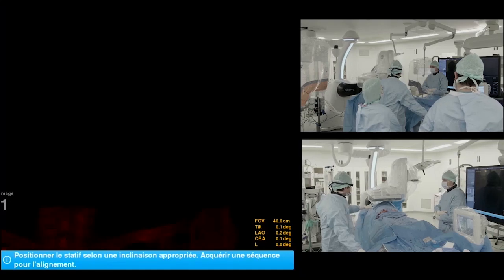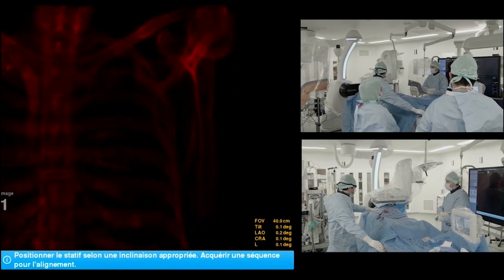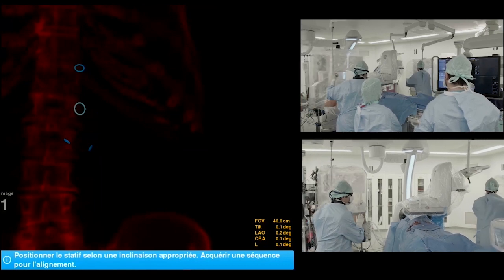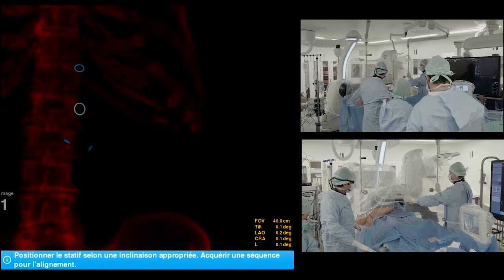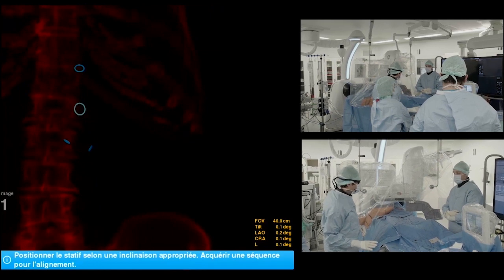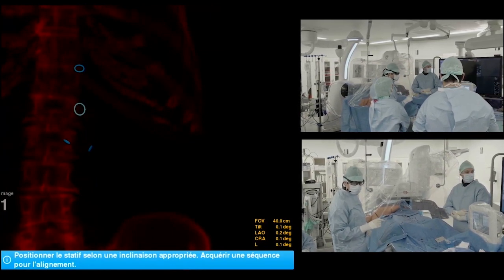So once the percutaneous approach has been performed with a ProGlide system on both sides, we now get the Discovery over the patient. So we switch from the open or percutaneous mode to the endo mode, and we are first going to register the fusion mask. For that purpose, we will do an AP fluoro and then a lateral fluoro.